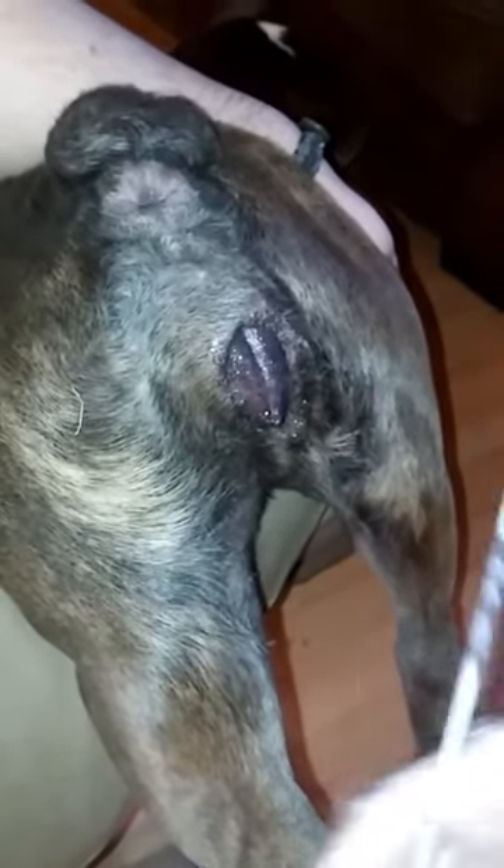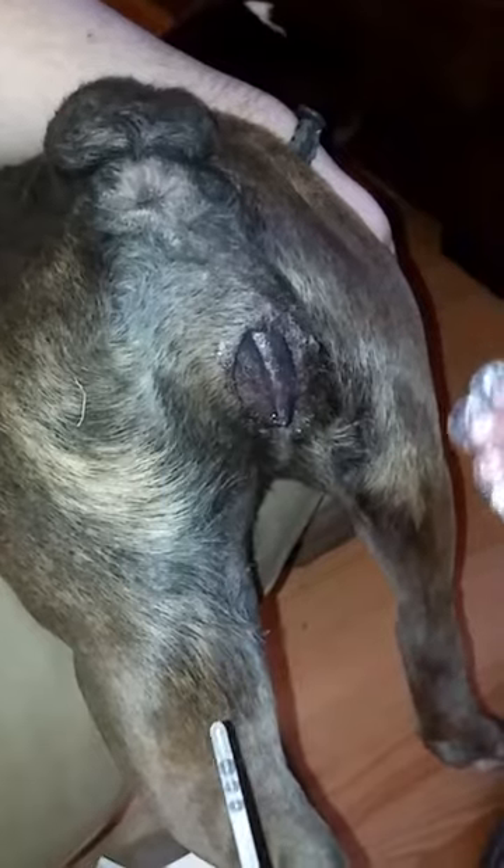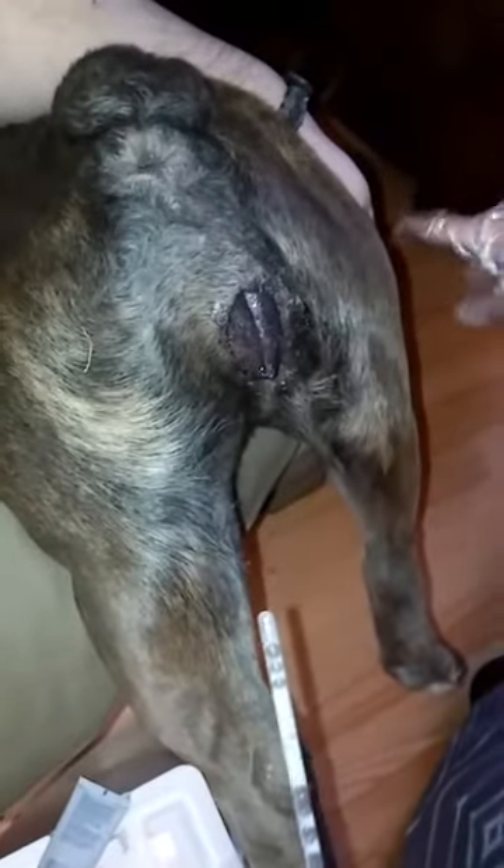Then take it and lube up the tube too. You want to have her elevated here — he's got her over his knee and her front is just down on the ground. Usually they'll stay for that. So she's elevated.